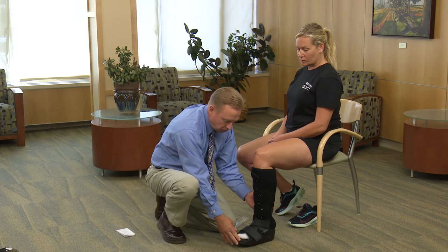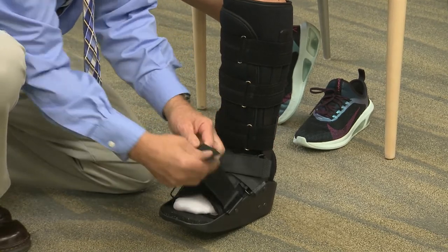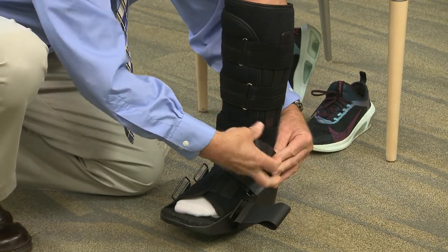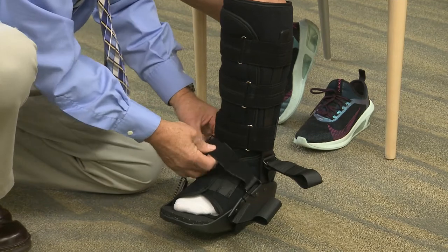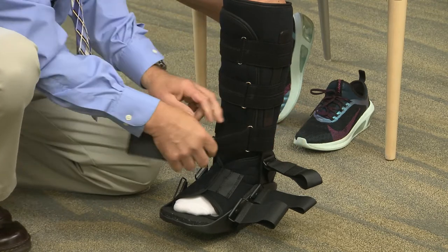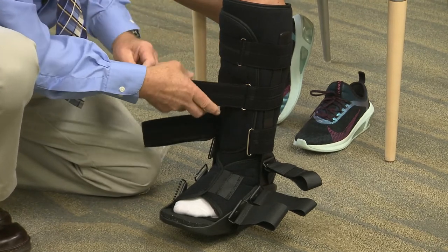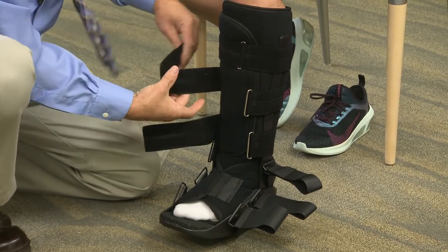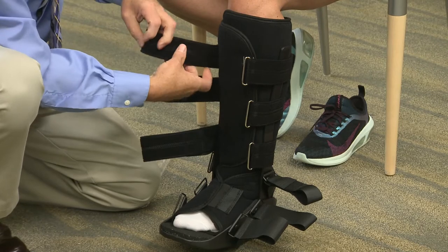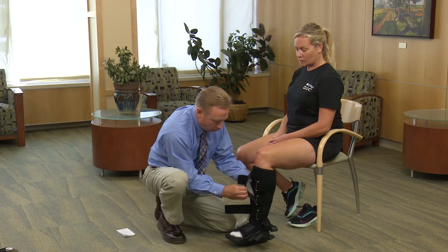Patients, all we want you to do when you come out of your boot is strictly undo your straps and connect it to itself. Remember those straps are crossed. You don't have to undo these anywhere else except at the buckle. If you've been told you can't take your foot out of the boot, there's a reason for that. If you've been told that you can take a shower, you need to come out of the boot. Do not take a shower with your boot on — it's not appropriate and it won't dry out.